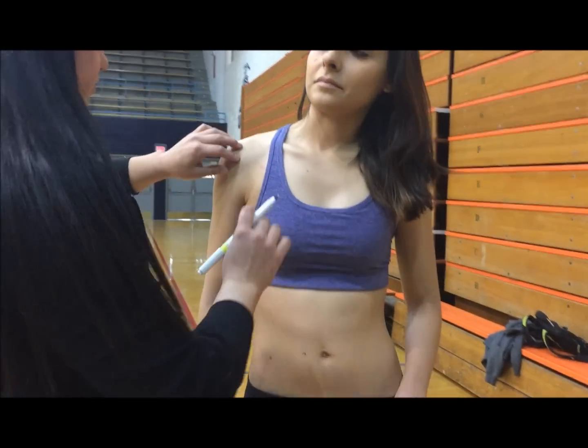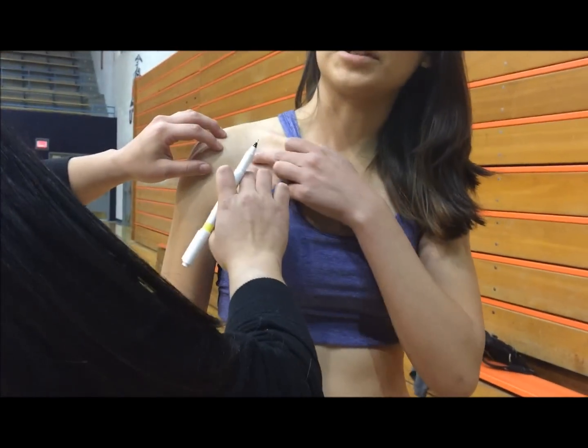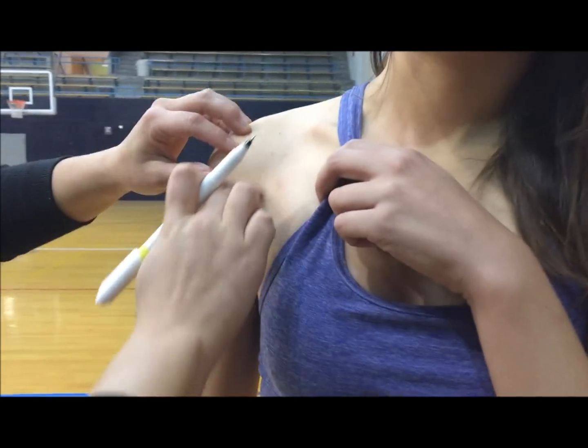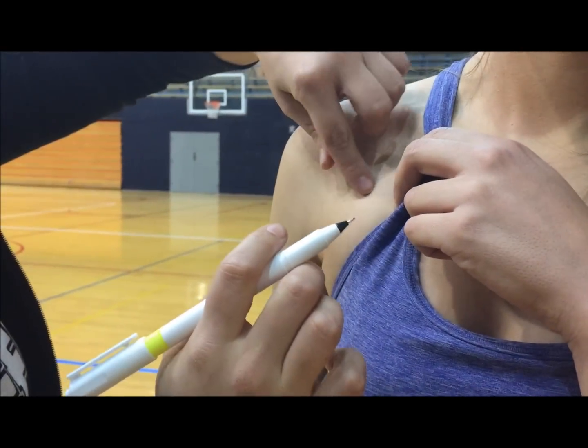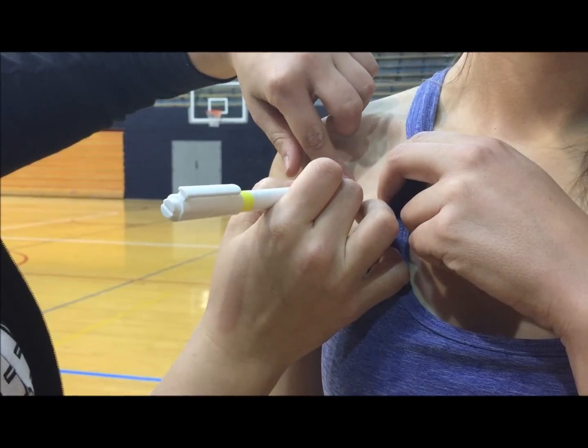We will next mark the chest area. For women, it is about one-third of the distance between the anterior axillary line and the nipple. For men, it will be half the distance between the axillary line and their nipple.